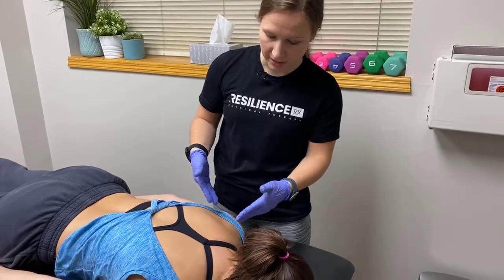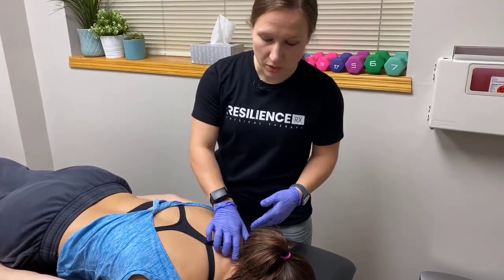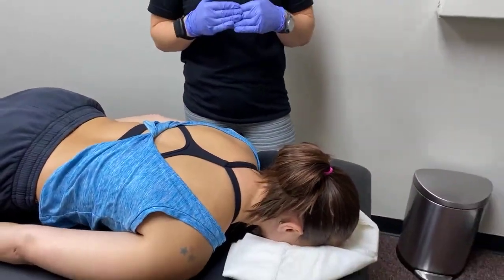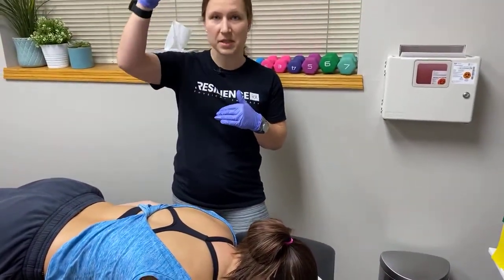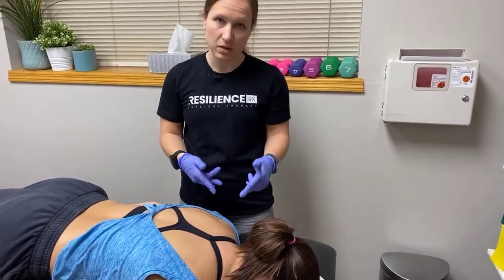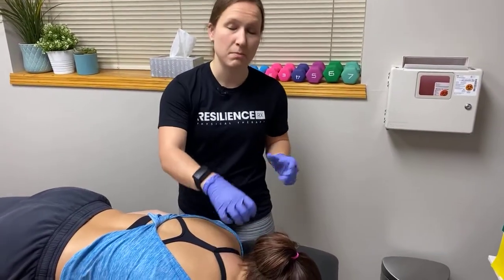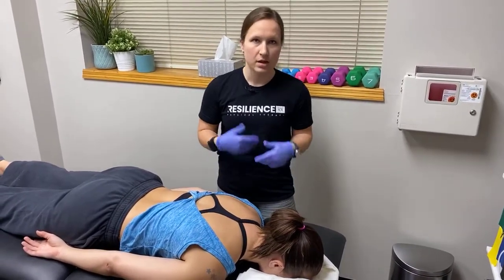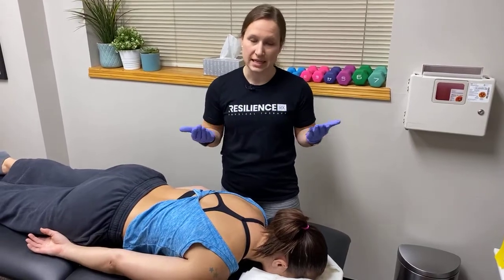With dry needling here, we'll target this muscle. We'll also target the C5 segment. So C5 means it's the cervical spine and it's the 5th disc down from the top. The reason we target that segment and we pair it with this muscle is because that segment is the part of the spine that primarily supplies energy to, or it innervates for the scientific word, but it basically supplies this muscle with the inputs that it needs to function.